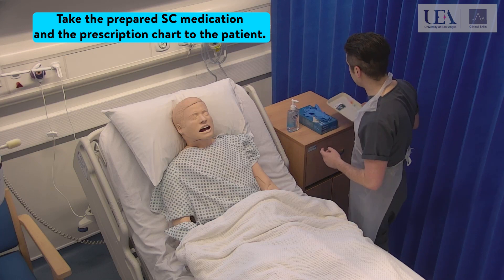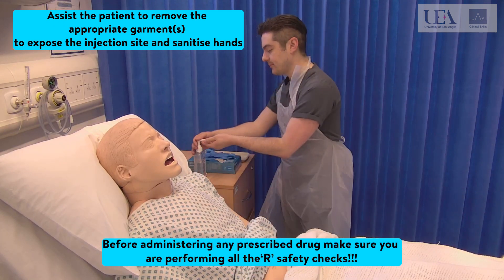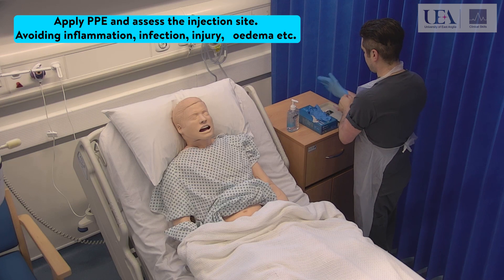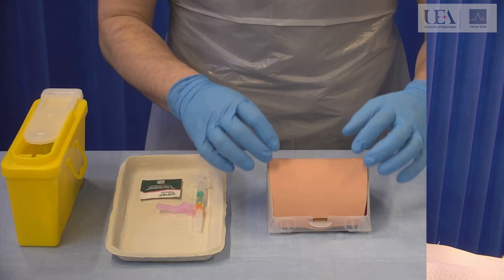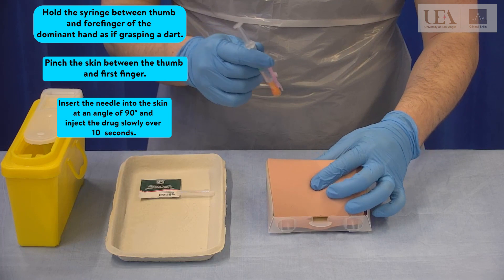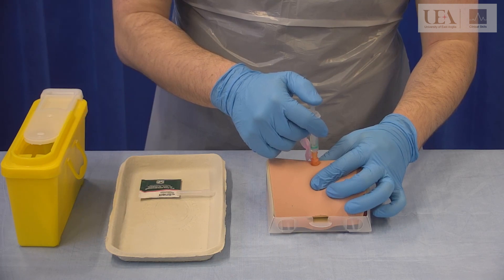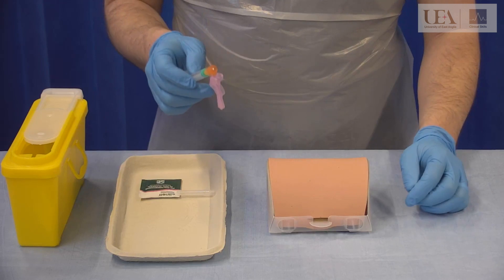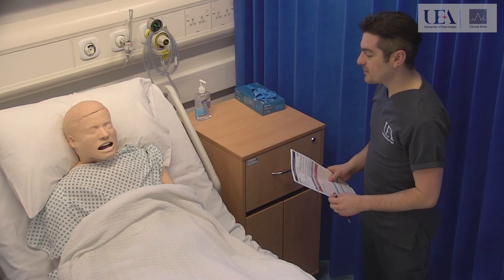I've prepared your injection. May I just expose the area where I'm going to inject? Thank you. That's your injection all done.